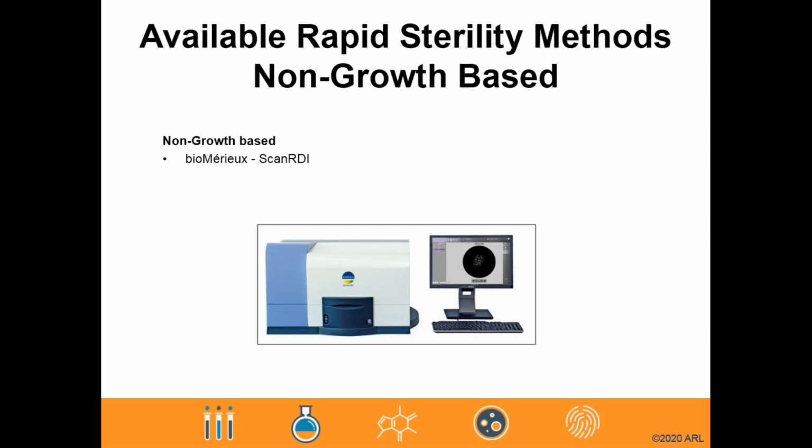Based on certain system settings, autofluorescent particles, membrane fluorescence, and background noise are rejected, and a total viable cell count is reported. Many firms also include a step where positive results are manually observed using a phase contrast microscope. This is done for confirmation of potential contamination.